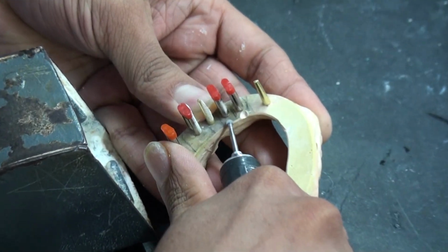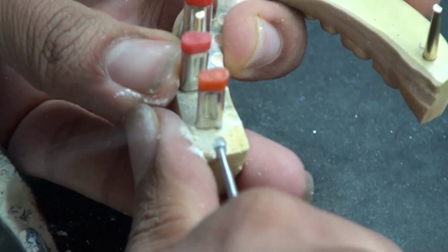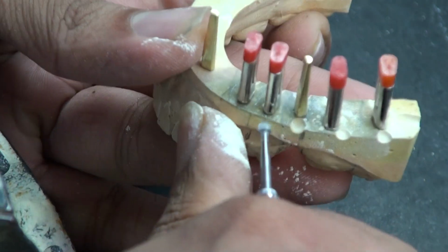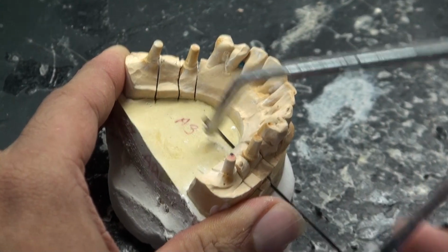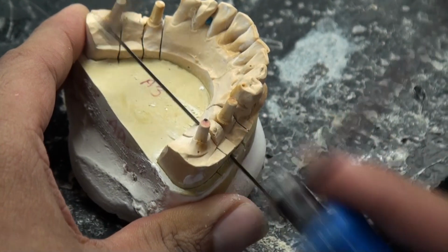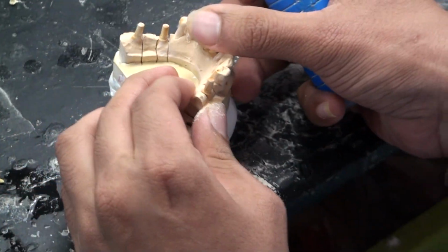These grooves, I believe, are for getting the orientation of the model to the base so that they both fit accurately together. So he's making various grooves, so there's only one way that the model can fit onto the base. And then he takes a little saw, and you can see he's starting to cut the dies. That's a few cuts done. Has to do it very accurately. There's a lot of skill involved in this, as you can see. Doing it slowly, there we go, and those are the dies getting separated now.